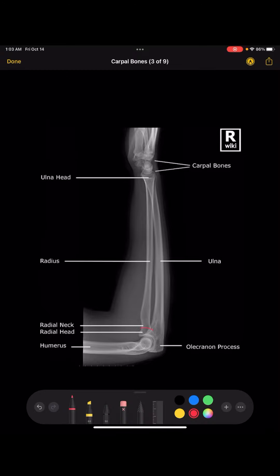You also need to make sure that the radial head is superimposed over the coronoid process, and that the radial tuberosity right here is facing anteriorly — basically facing this way.